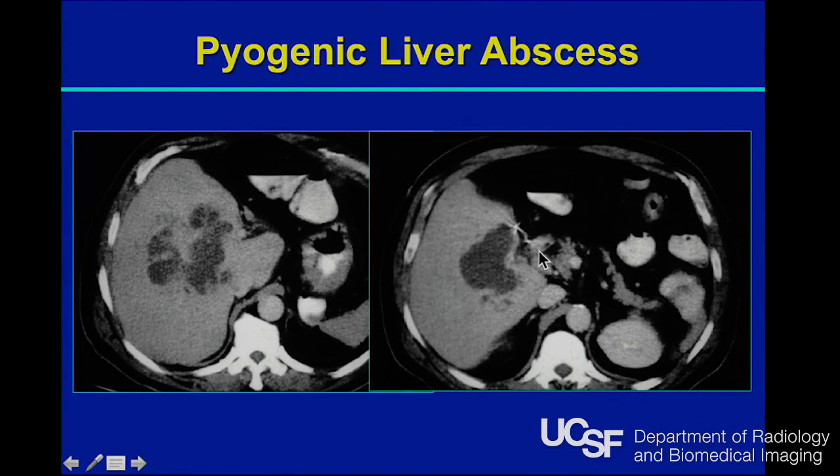All right, what about liver abscesses? Now, the tough thing about liver abscesses is that they're not always drainable, because it might look like an abscess, like it does here, but as you can see, there's a lot of tissue within this cavity that is semi-solid or solid, and it's not going to be coming out through the tube.